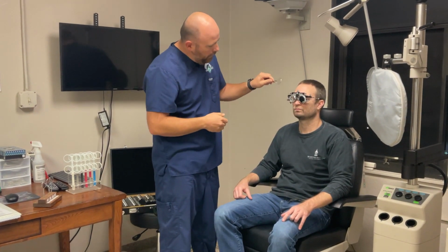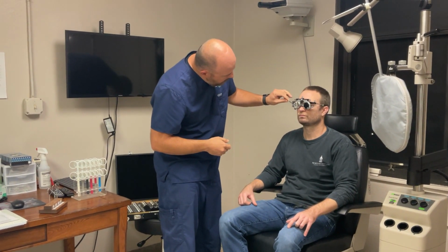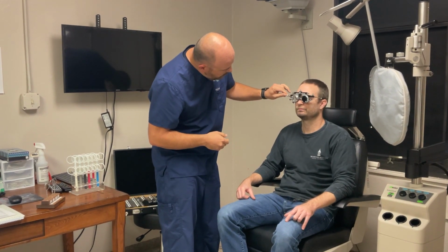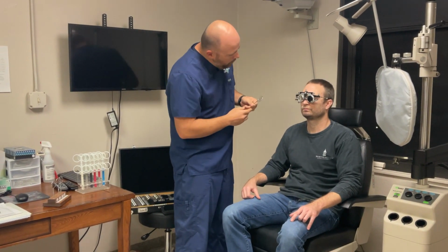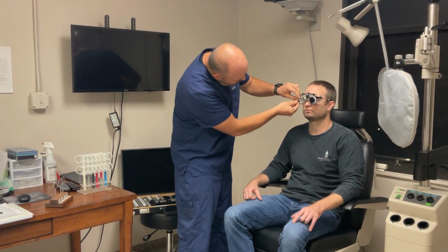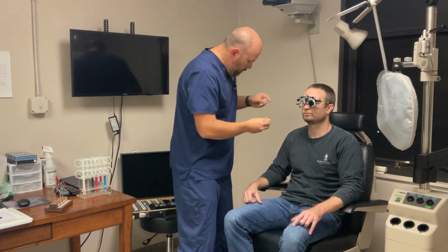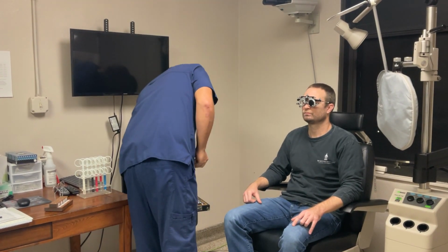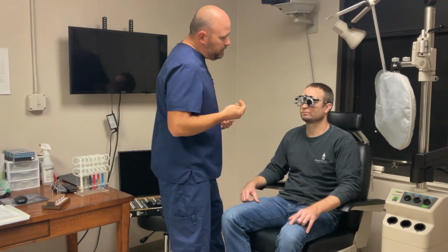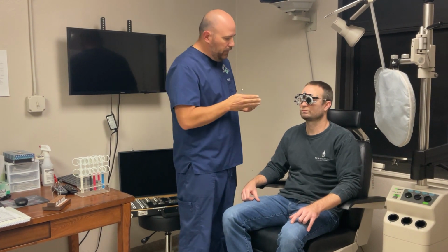All right. And looking up there, still at that C, better 1 or 2? 1. 1 was better here? Mm-hmm. Okay. Now the patient accepted more plus there, and so now I'm going to drop down from a 125 to a minus 50.